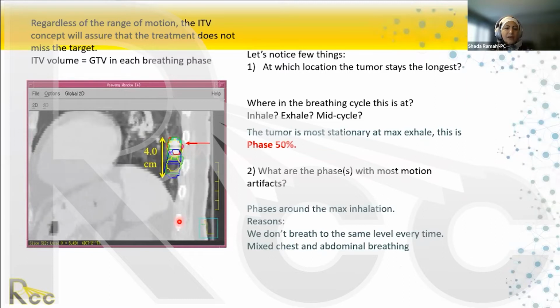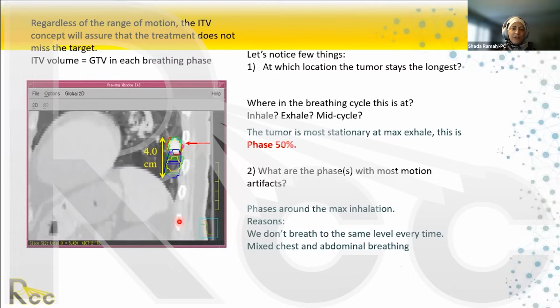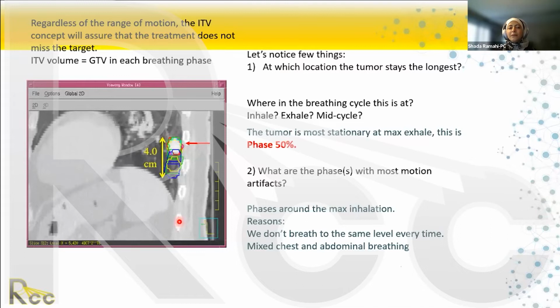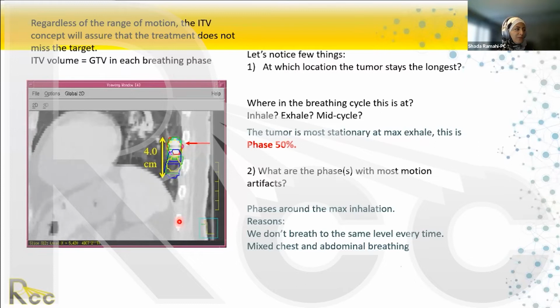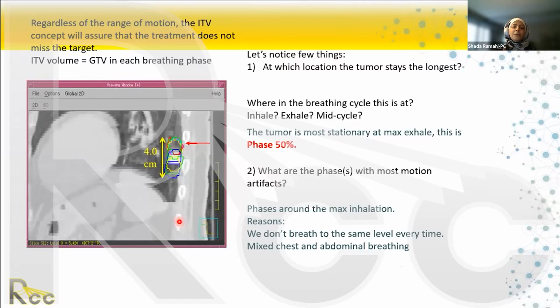The reason is every time we exhale until there's no more oxygen in our lungs, it's almost the same level of exhalation. You exhale until you're done. There's nothing else to blow out. However, every time we inhale, it depends on our status. It depends if I'm stressed out. Maybe something just scared me a minute ago, or I'm short of breath because I'm speaking very quickly. We inhale to different levels. So exhale is consistent.